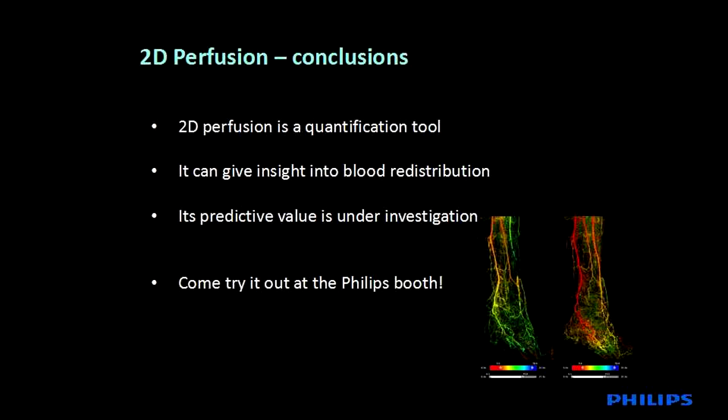Meanwhile, let me draw some conclusions. 2D perfusion is a quantification tool. It can give you insight into the blood redistribution before and after a treatment in your area of interest. And its predictive clinical value is currently under investigation.